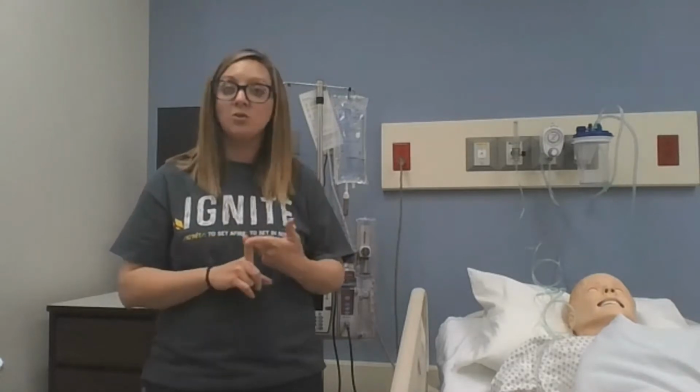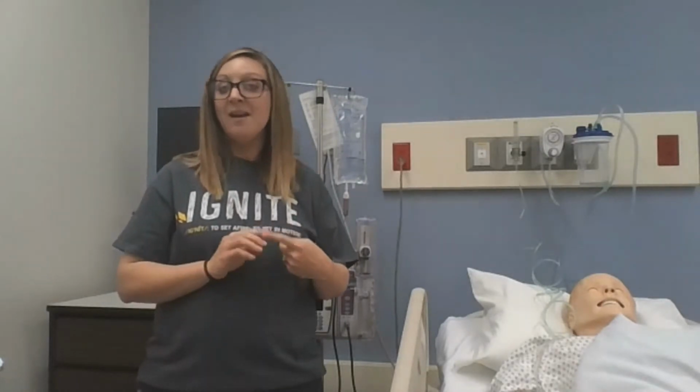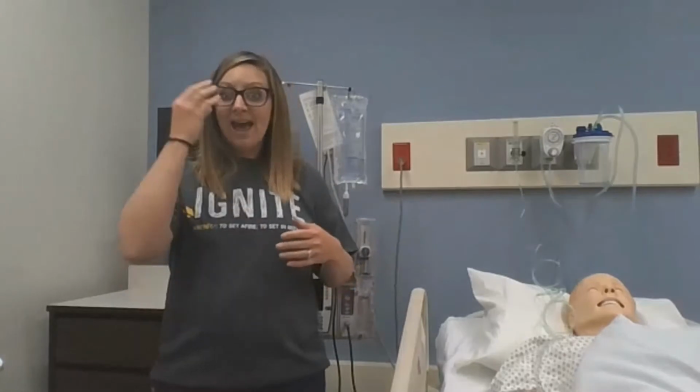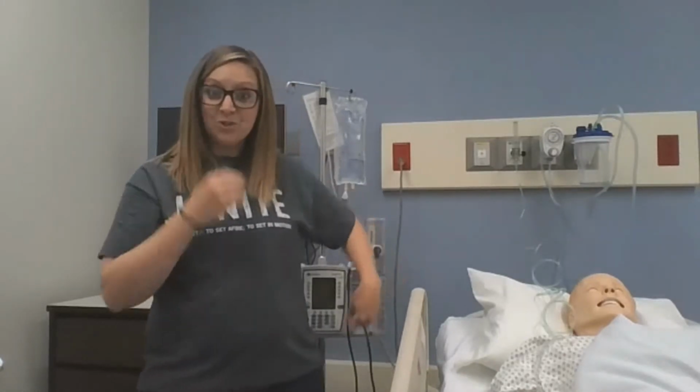PCAs come in an order set or a power plan. And what that means is when they order the PCA pump, it comes with automatic additional orders that require the patient to be on O2 at 2 liters via nasal cannula. That's regardless of their SpO2 reading. So even if their stats are sitting right at 100% on room air, because they have a PCA pump attached to them, we are automatically going to put them on O2 at 2 liters. It also requires CO2 monitoring, and that's something that we're going to talk about here. So they have a nasal cannula that's attached to a CO2 monitor.